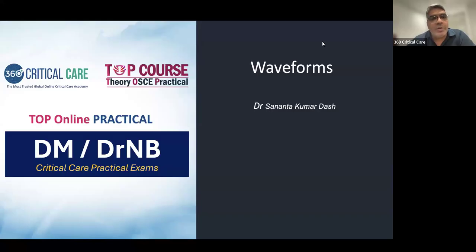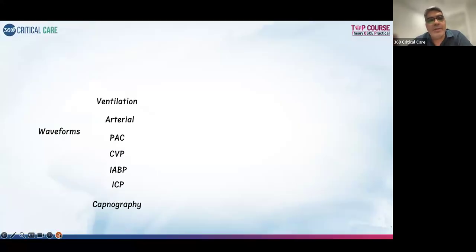Good afternoon. Today we'll be talking about the waveform part of the OSCE exam, which is pertinent to the DRNB or DM critical care exam. This has been fragmented into different sections, and various faculties are taking different parts of it. I am assigned the ventilator graphics, arterial waveform, CVP waveform and ICP waveform. The rest of the list will be covered by someone else.